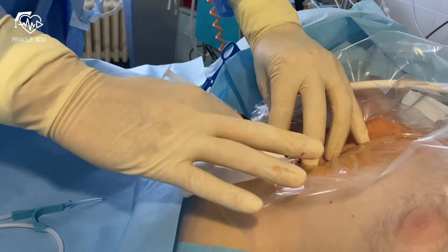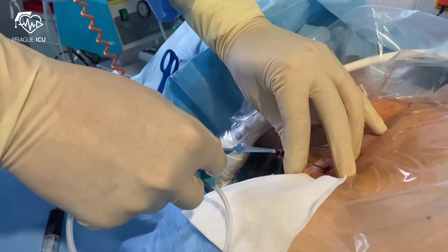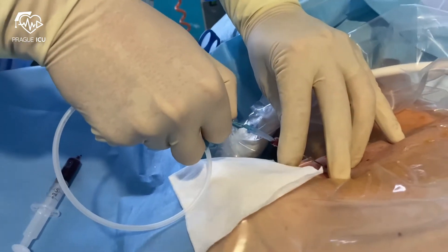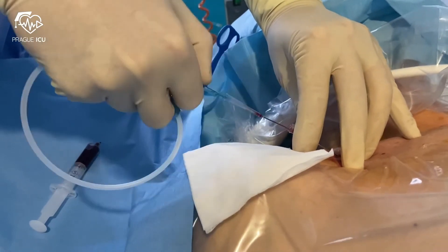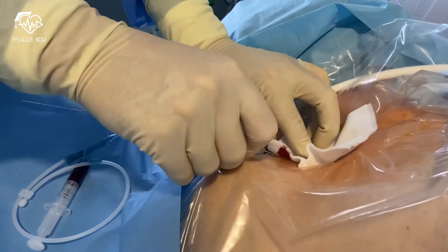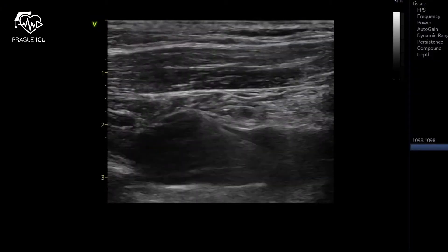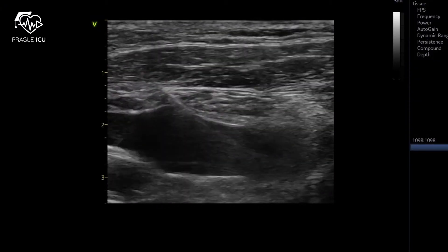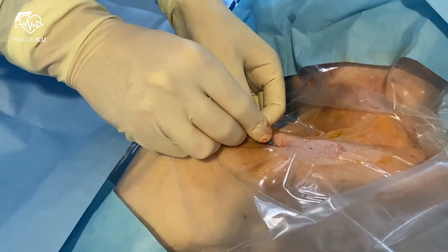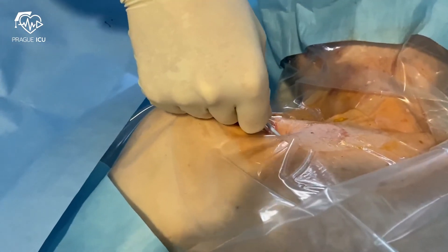When a flush of dark non-pulsatile blood is obtained, advance the wire into the needle. Withdraw the needle while leaving the guide wire in place. Double check the position of the wire inside the vein with ultrasound. Make a small superficial incision at the entry point of the wire to facilitate passage of the dilator. Insert the dilator using a rotating motion and avoid bending or kinking of the wire.